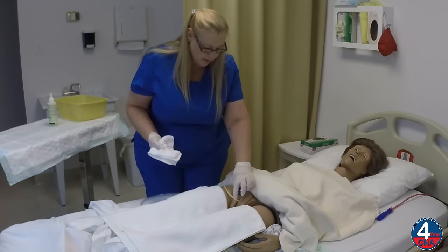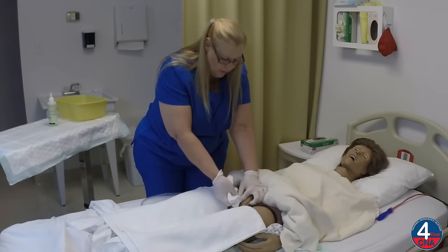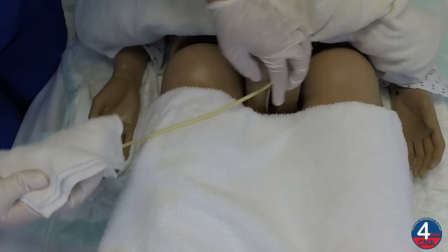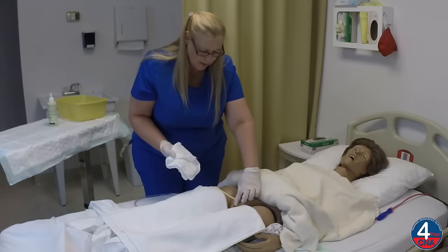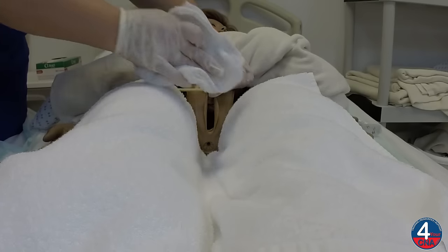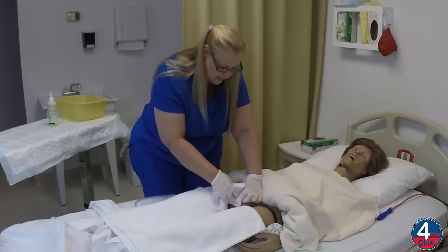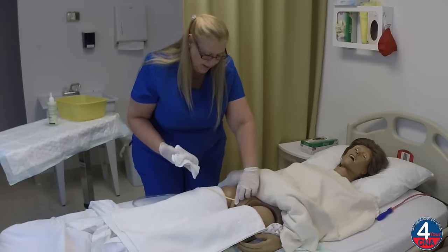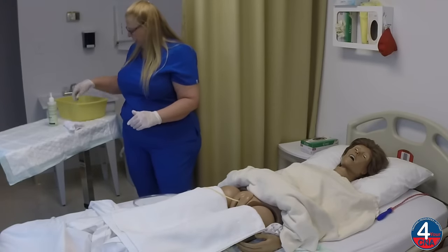Now I'm going to clean your catheter. I'm going to hold the catheter where it exits the body, wrap the washcloth around, and wipe away from the body. Fold that leaf over. I'm going to hold it, wrap the washcloth around, and wipe away from the body — that's two. We're going to do this two more times, away from the body: three, and the last one, four. I'll set this washcloth aside.